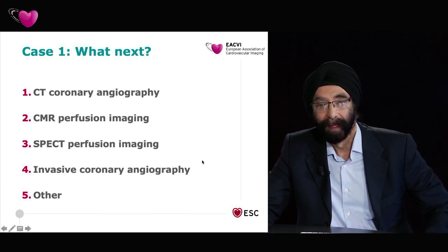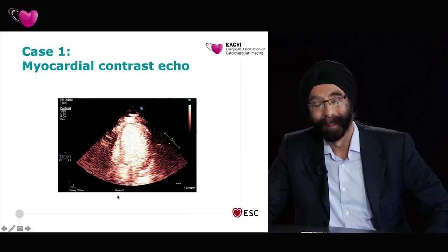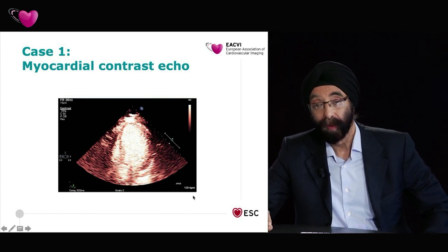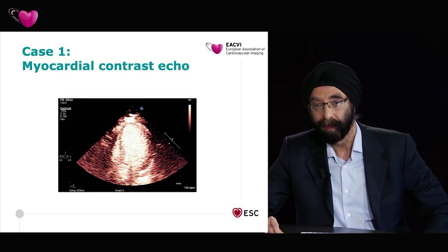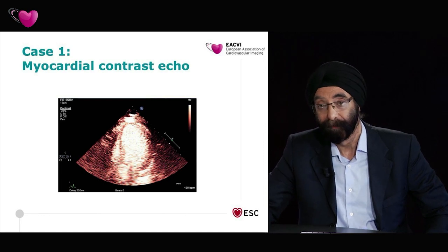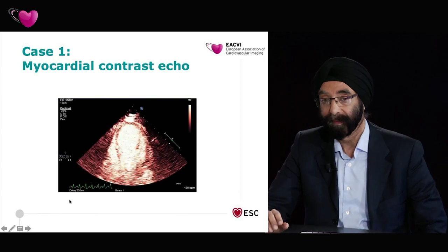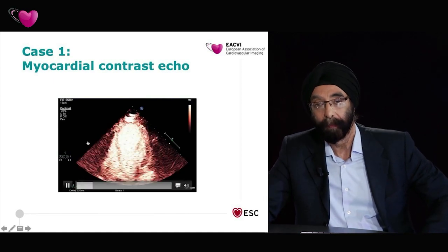And of course, this is a contrast echo workshop, so I've used this example for that reason also. When the patient had the wall motion images taken, her heart rate was still quite high at 128 beats per minute. So when the patient lies on the couch, for practical purposes, we then connect the SonoView contrast infusion. And so we have continued steady state flow of contrast. So we then assess myocardial perfusion. And this is what we did in her case. So this is the same sitting. They've had the resting echo, they've had the stress echo, and now they're having the myocardial contrast echo.